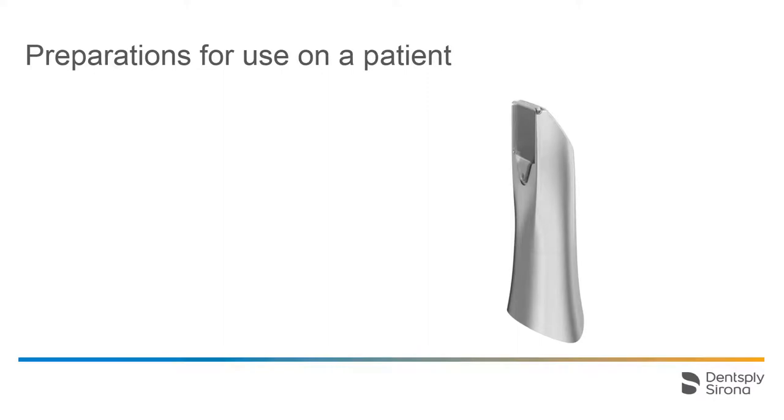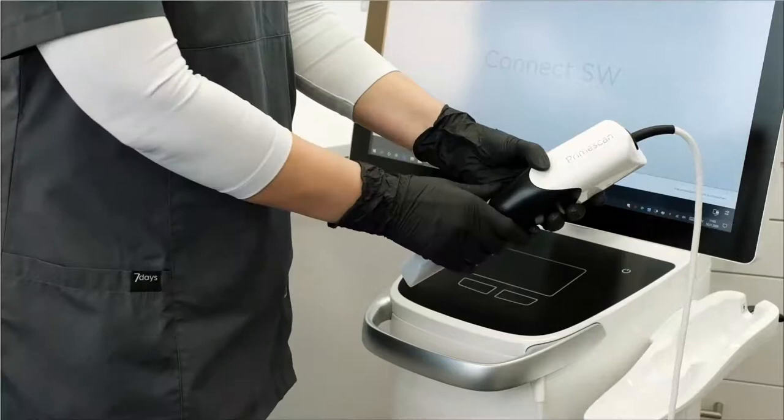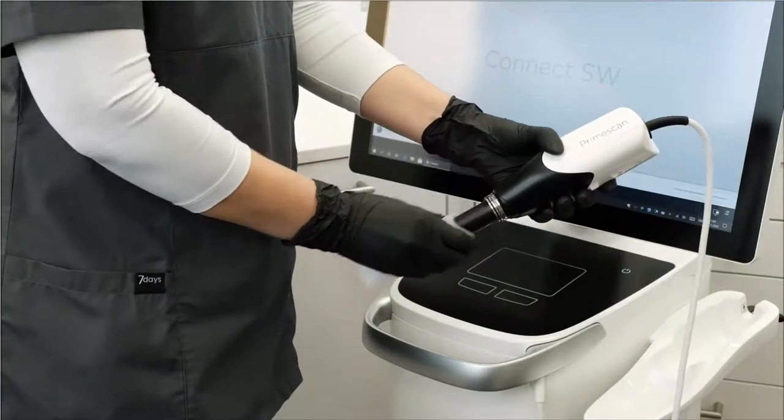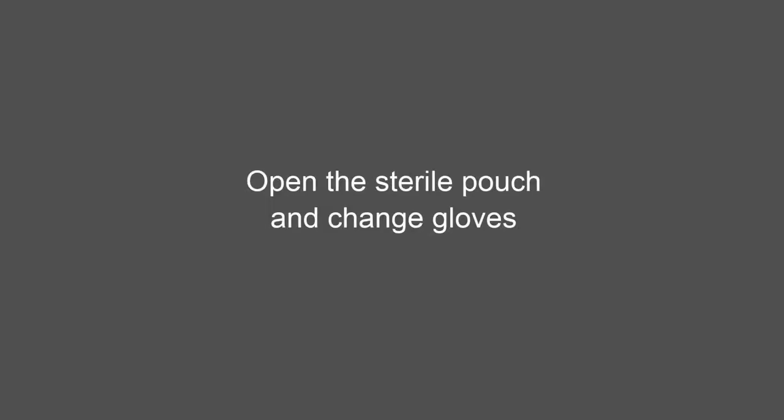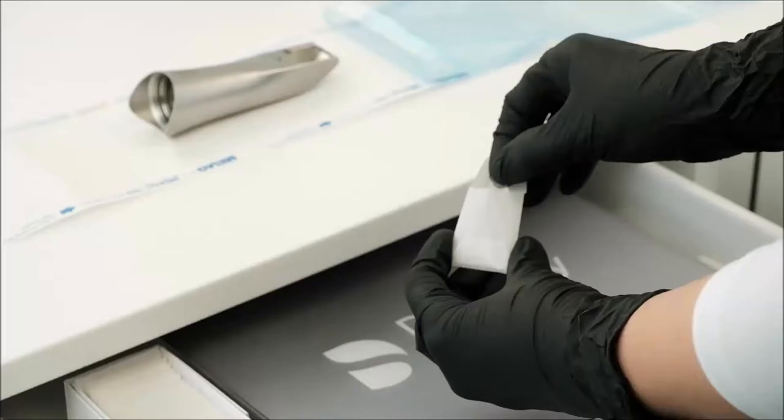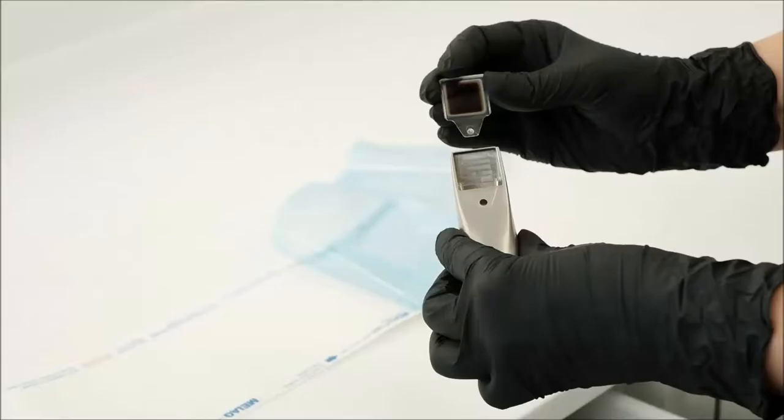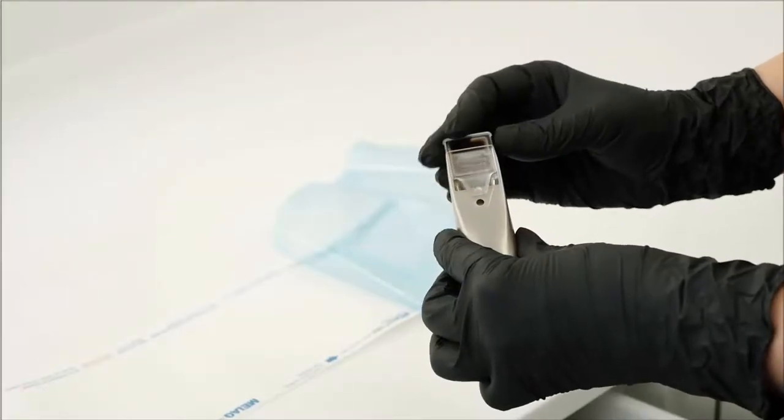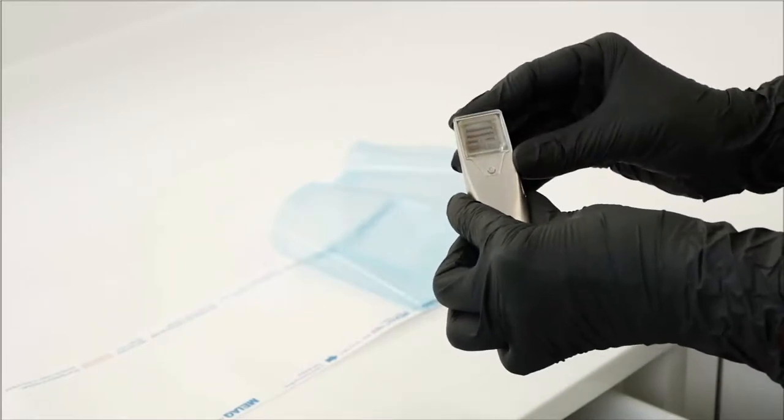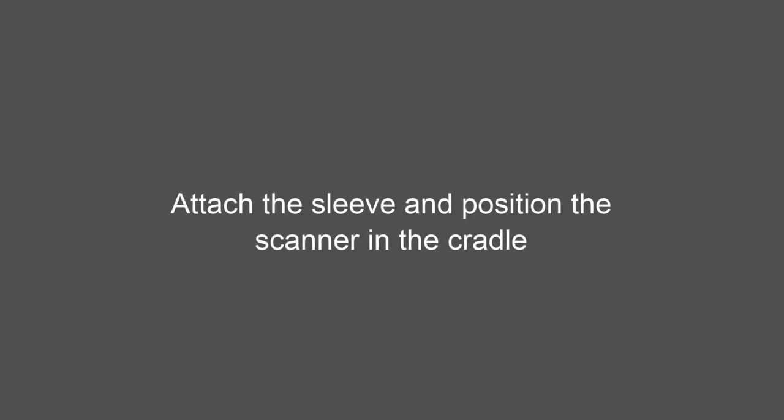Now, let's look at the preparations for use on the patient. Start by removing the white protective sleeve from the PrimeScan. Open the sterile pouch of the sleeve and put on clean gloves. Make sure the small notch fully snaps into place. Attach the sleeve, position the scanner in the cradle, and start using as soon as it's warmed up.